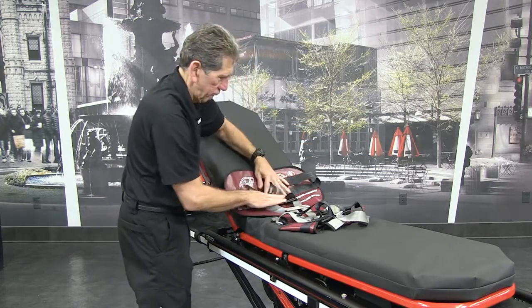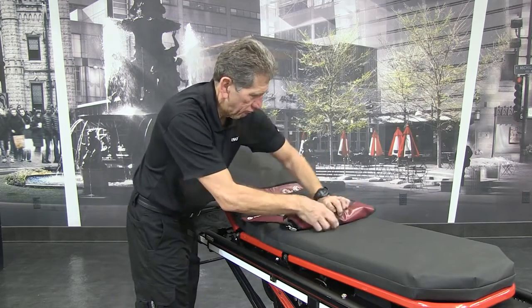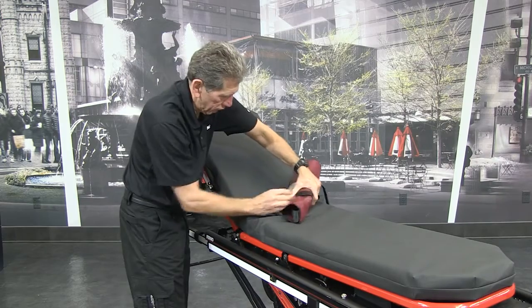Beginning at the crotch panel, fold the PDMATE upward. Secure the roll with the Velcro straps.